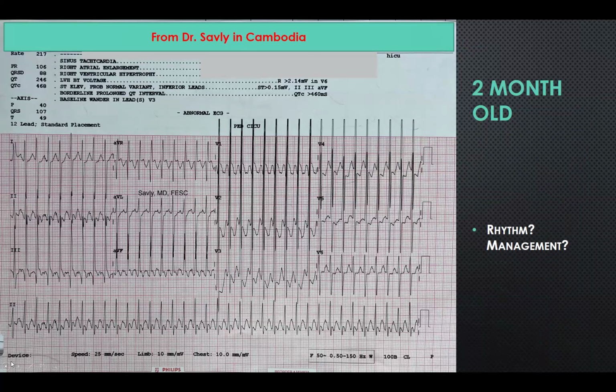So Molly, since you asked the question, if that happened and the patient went into VF, what would you do? I mean, you would do what you just did. Would you synchronize it or unsynchronize it if you were in VF? Unsynchronized. Unsynchronized. But how many joules per kilo would you give? You would do higher, so like 1 to 2. No, for ventricular arrhythmias, it would be 2 joules per kilo. Oh, 2 at minimum. Okay. Okay, I'm glad you brought that point up, Molly.